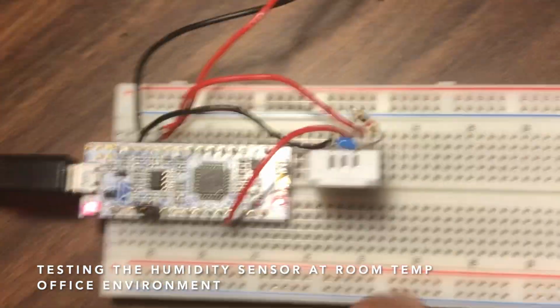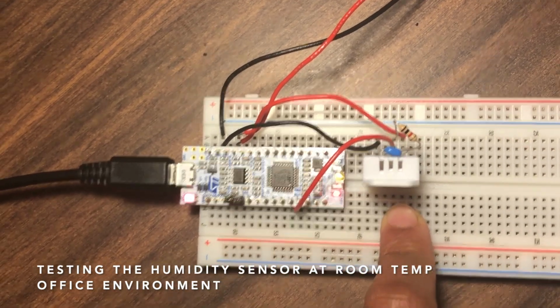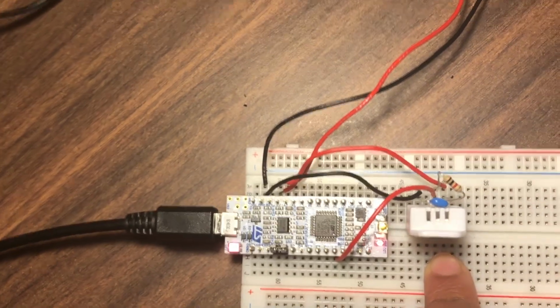So before I built a control system, I just wanted to test the function of my digital relative humidity sensor at room temperature in my office. And so when we look at the serial output from CoolTerm, we can see that we're getting a temperature of 23 degrees Celsius and a relative humidity of 52% plus or minus 2%, which is very reasonable for an internal office environment.